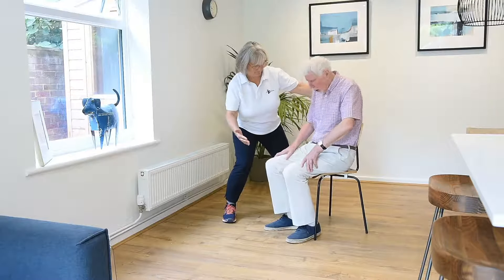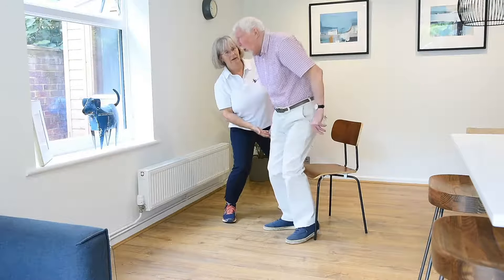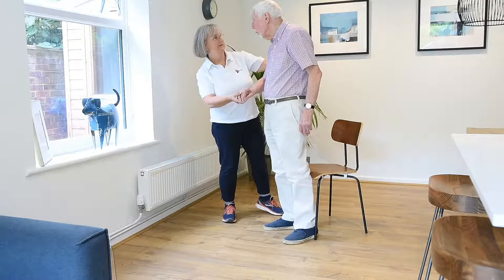As professionals, we often observe clients who struggle to stand from a chair due to reduced muscle strength and/or impaired balance.